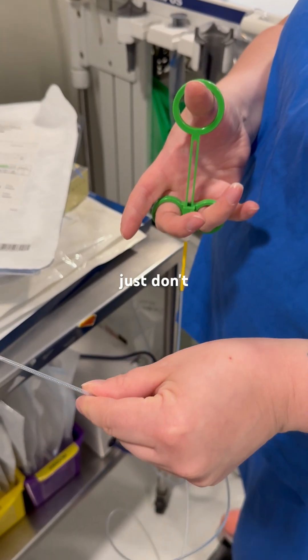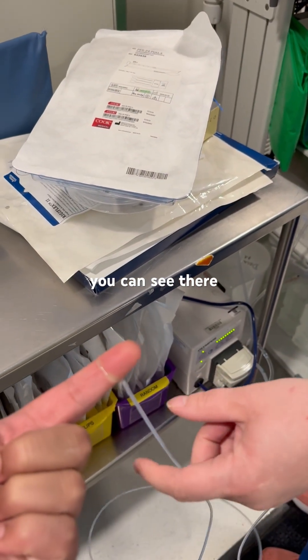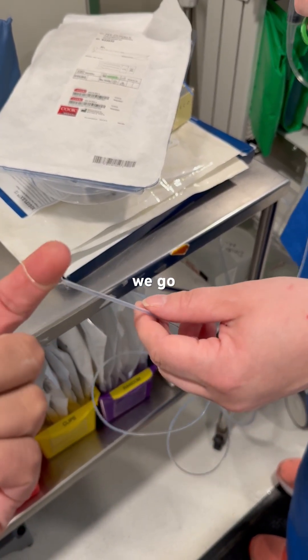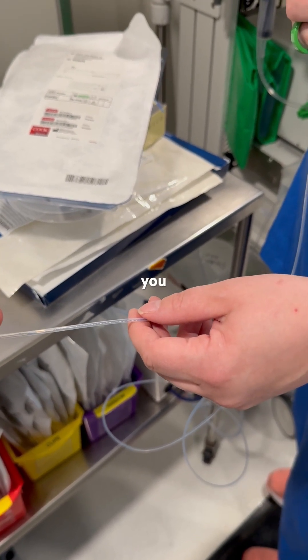Pretend my finger is a polyp — just don't take it off. You can see there, it is nice and comfortable. It does not feel pain, nothing like that. Very easy. You can let go now.